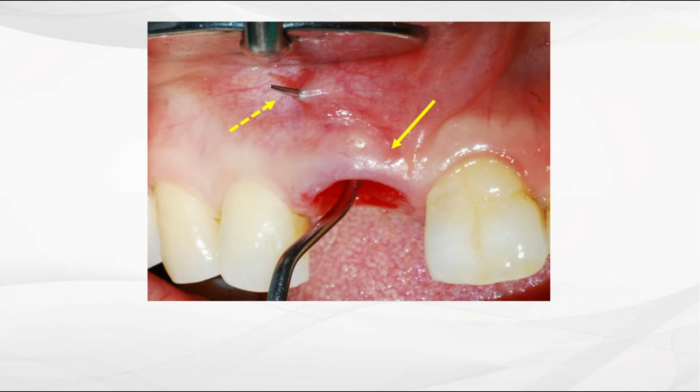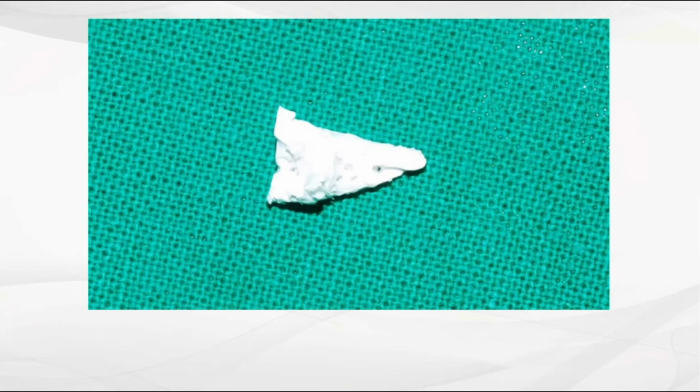to preserve the fractured labial cortical bone plate, a dentin block coated with BMP was used. For socket preservation, dentin powder coated with BMP also was used. Let's see the video that summarizes the surgical procedure.